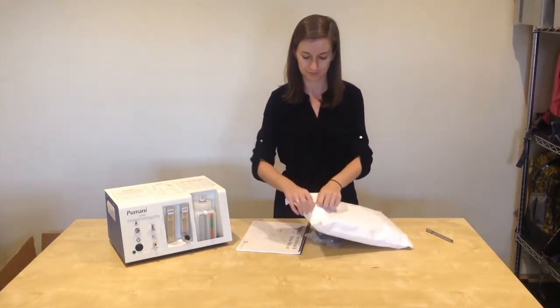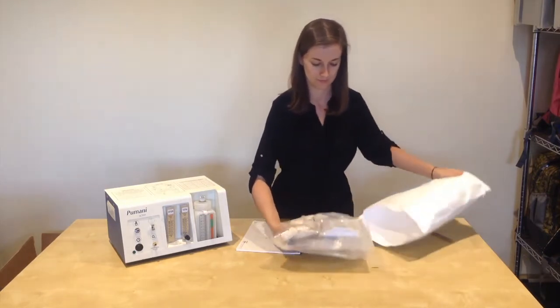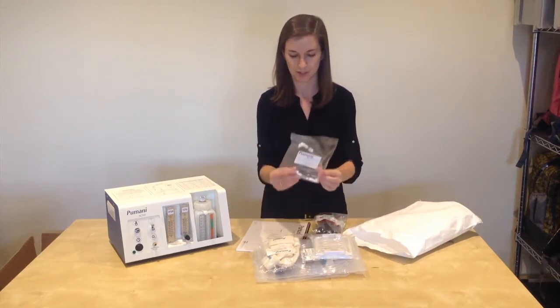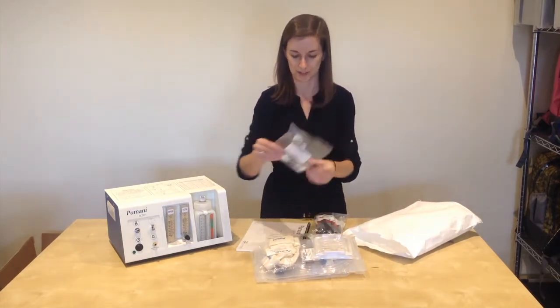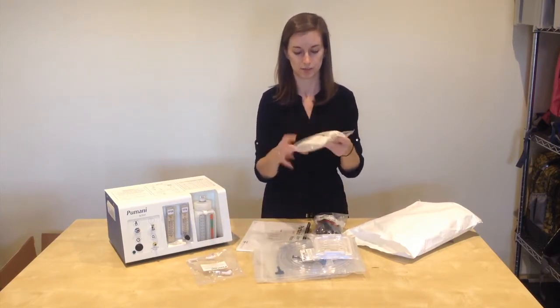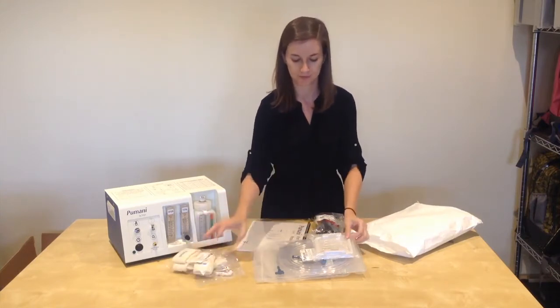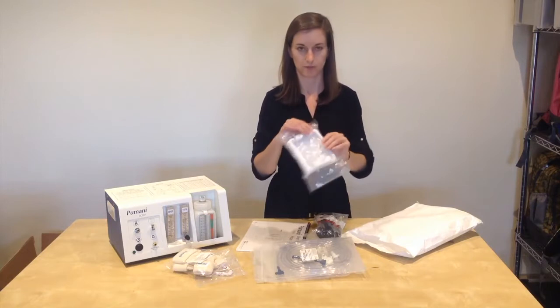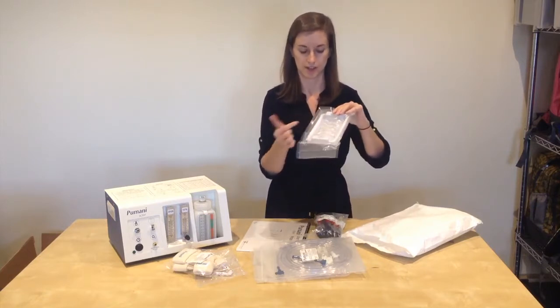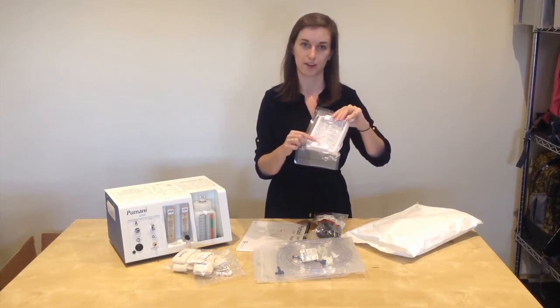If you open the pack, it will contain the following items: the bottle tubing, a set of hats which contains one large hat, one medium hat, and one small hat. One set of variety pack of prongs — there are six prongs here, sizes 0, 1, 2, 3, 4, and 5 in the pack.